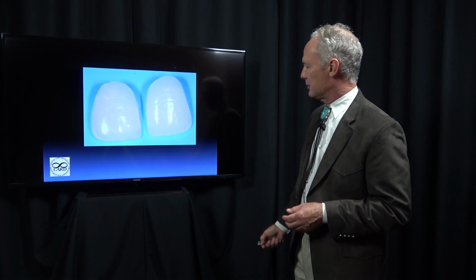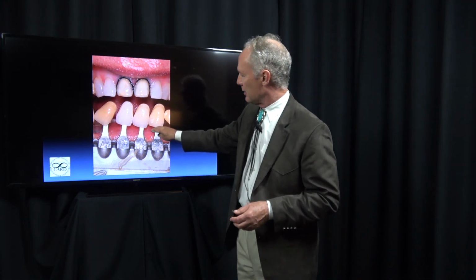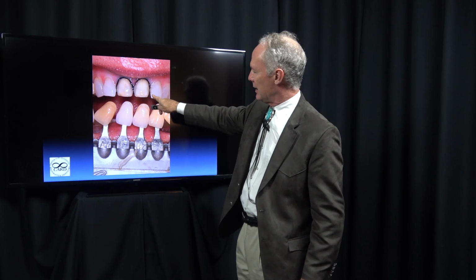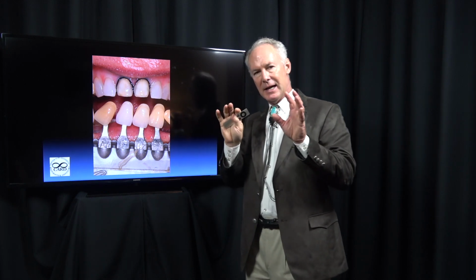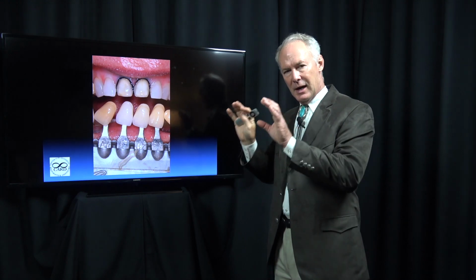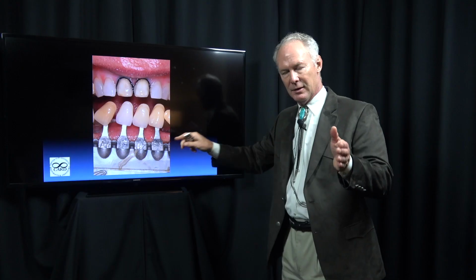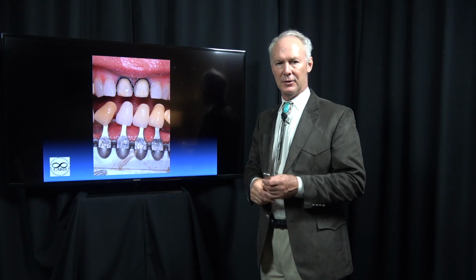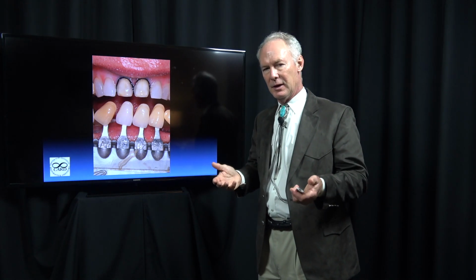Then once I prep the tooth, I'm going to take another photograph with the stock shade tabs so the technician can see the stump shade of the tooth that he's having to cover and hide with the veneer. I want most of the hue, chroma, and value of the veneer to be determined with the veneer, not with the cement. The cement can influence the final hue, chroma, and value, but I don't want a translucent veneer in very many cases. I want some opacity, some character in that veneer that determines the final outcome.